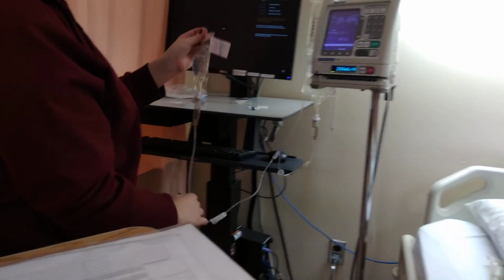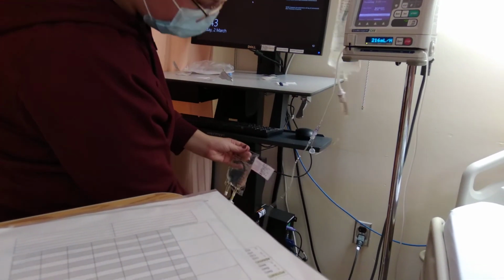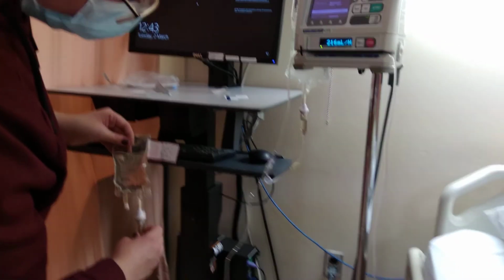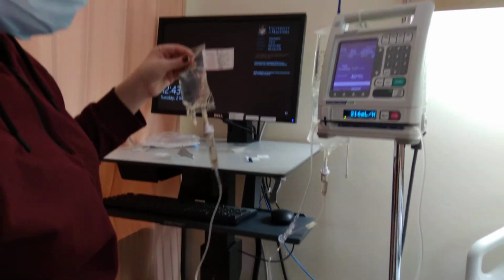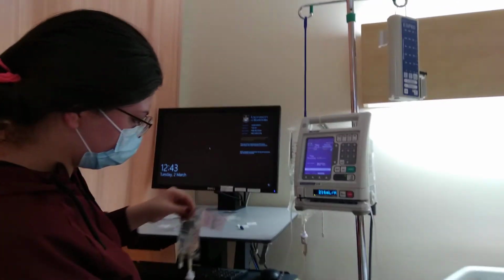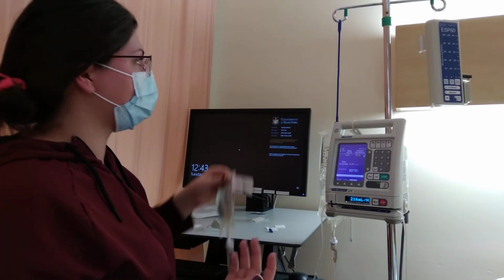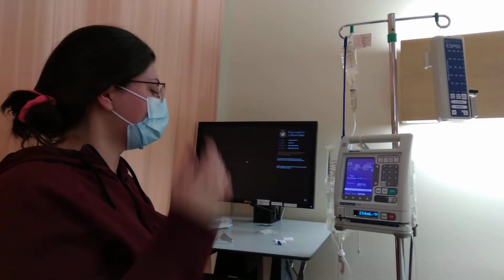My name is Avin Okumo. I'm a student. So I have to identify my patient. Come on. So right patient. It's not working. After I'll go to my health check. I'm not sure why. Okay, so we're gonna pretend that I was able to get rid of the air in there.